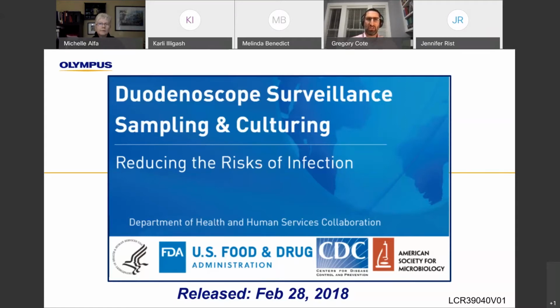So I think this is the balance that the FDA and other regulatory bodies have had to face. They are providing us with a very thoughtful process to culture your equipment. And I think it is a good idea to be familiar with this and to do it in your unit intermittently, again, as a quality check, really on your processes, as well as on your technicians, on your team.